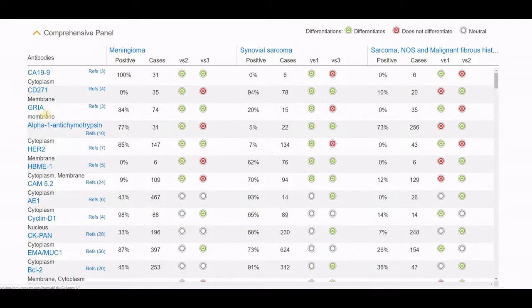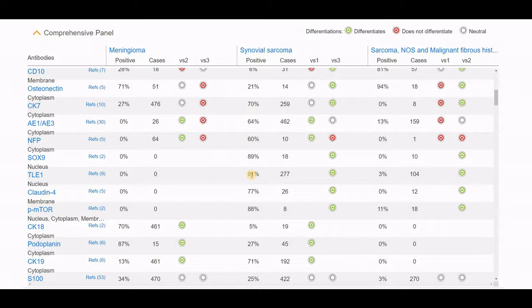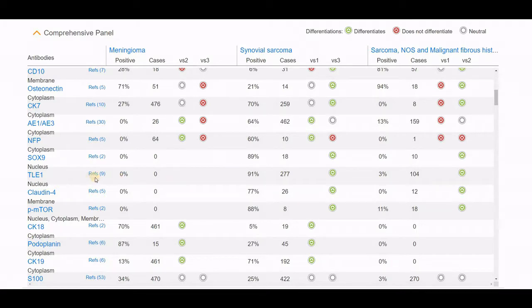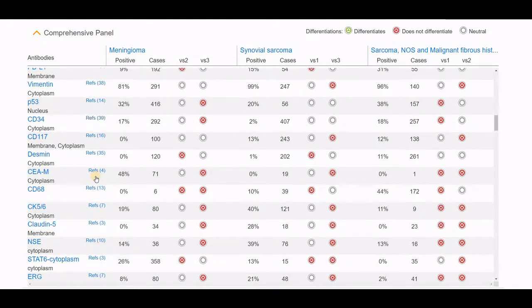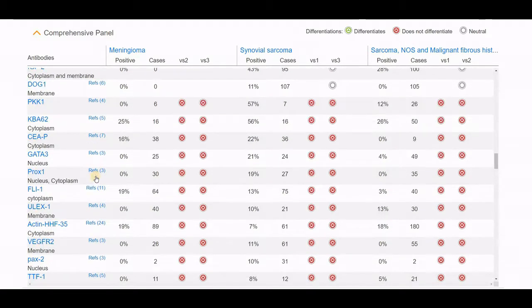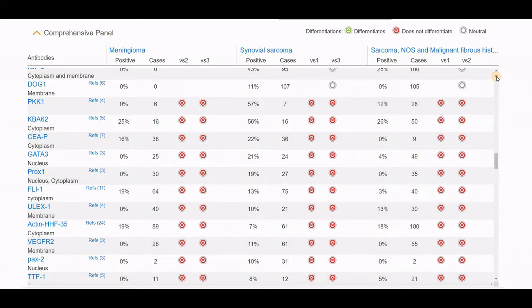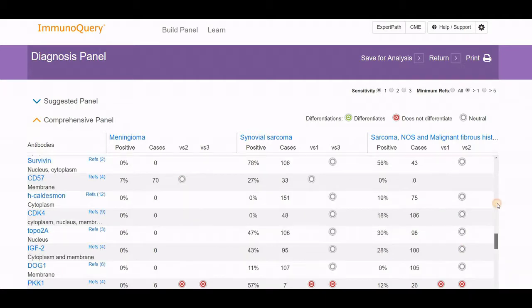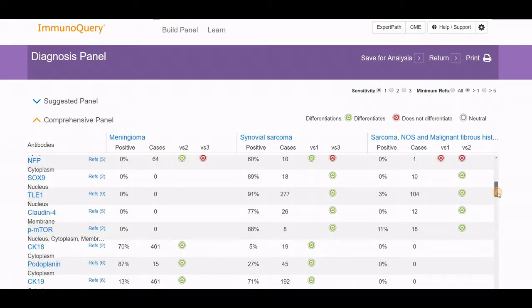CA19-9 being present in so many meningiomas is certainly helpful. But as I scroll down, I can see that TLE-1 is also helpful and present in 91% of synovial sarcomas, while not present in very many undifferentiated sarcomas or malignant fibrous histiocytoma. So that would be another marker you could use. For this differential, there are dozens of different antibodies included for consideration. Once you get down to about 50% of the way, these are not going to help very much, either because they're positive to a certain degree in each tumor or not positive in sufficient numbers to be of value.